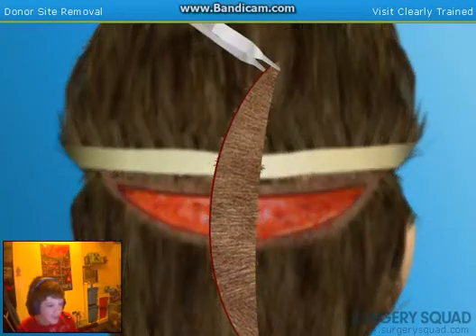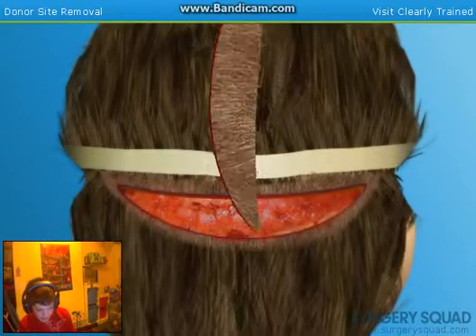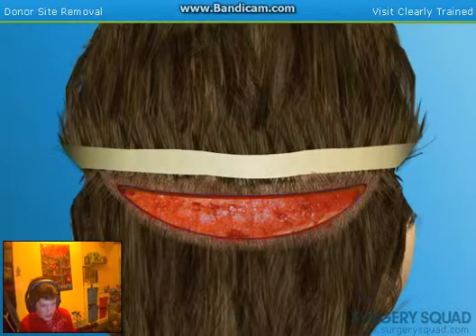Once removed, we'll prepare the piece of scalp for grafting by dissecting the individual follicles. But before we do that, why don't you go ahead and suture the donor site?